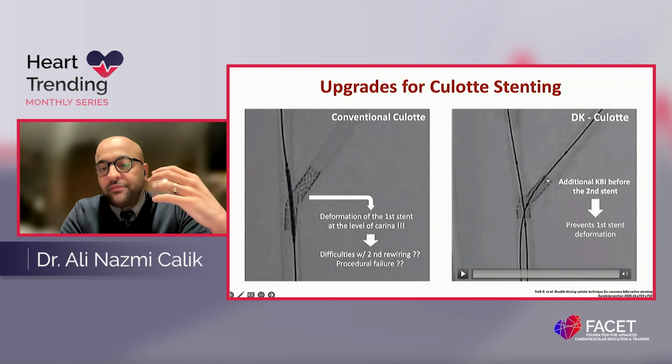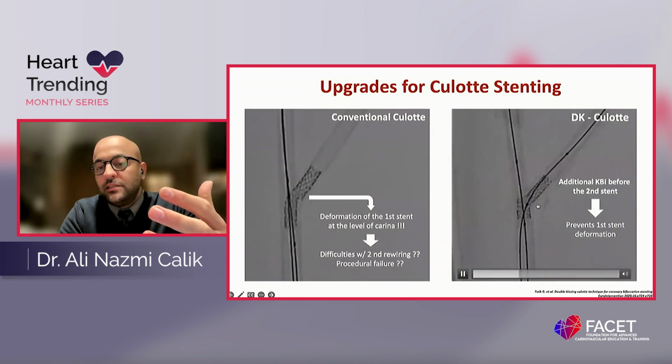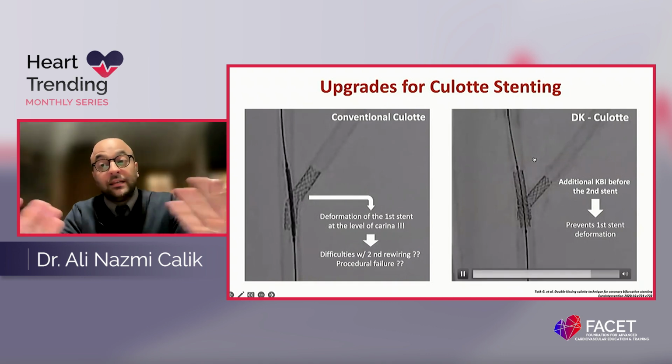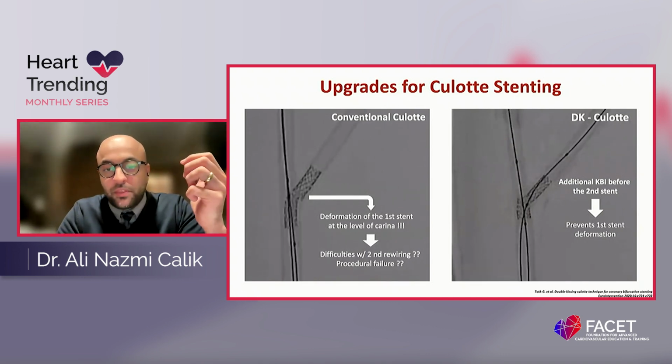Instead, after putting the first stent, it is now recommended to perform a kissing, which allows you a better apposition, and then we put the second stent. So we prevented deformation of the first stent, and to be honest, I apply this to my daily practice.